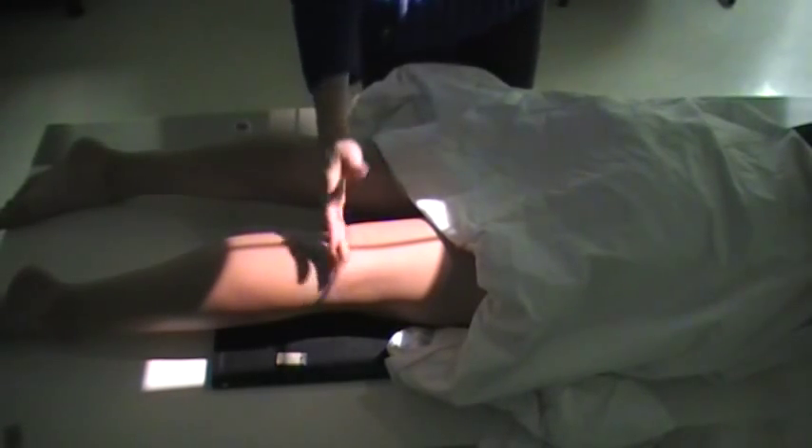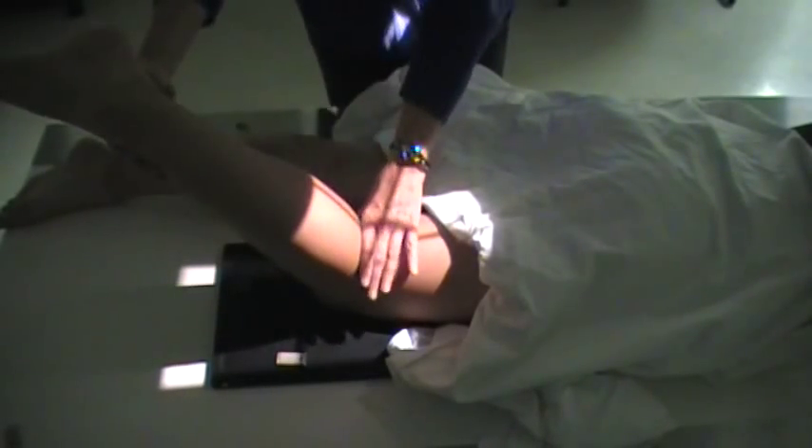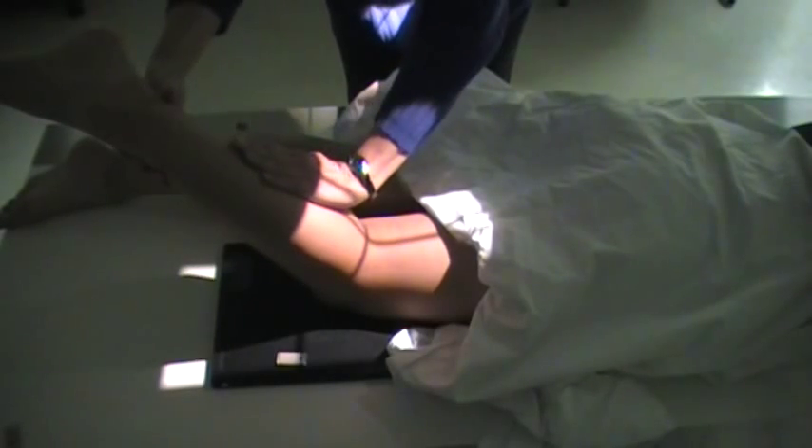Next, I'm going to do the Camp Coventry method. With the Camp Coventry method, I'm going to have a 40-degree caudal angle on my tube, and the central ray is also going to enter at the bend of the knee. I'm going to bend this tibia-fibula up — we're bending at the knee. The tibia-fibula surface is going to be parallel with the surface of the face of the x-ray tube. So the angle of the tibia-fibula with the IR is approximately at a 40-degree angle, the same as the x-ray tube, but we're going to enter at the bend of the knee.